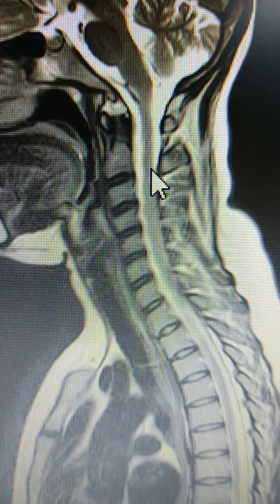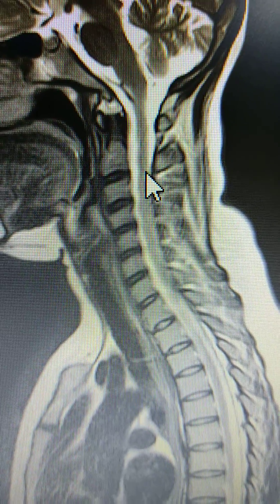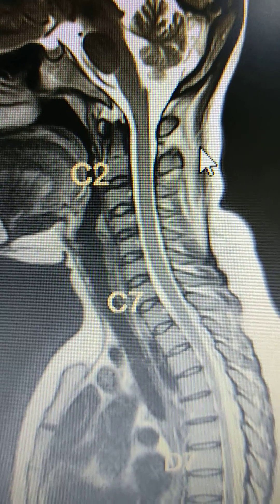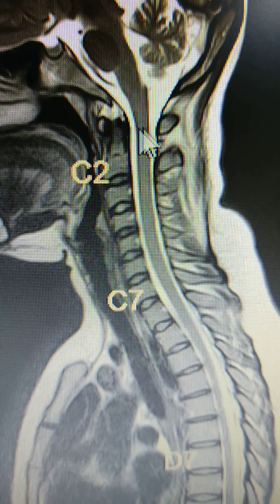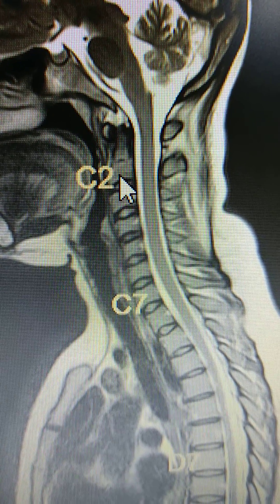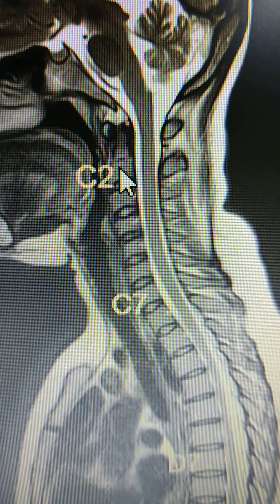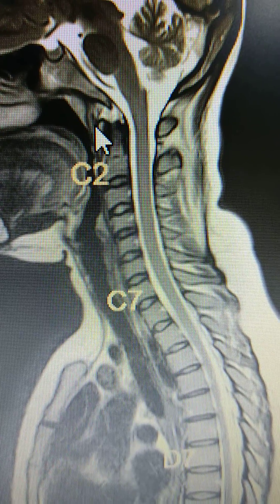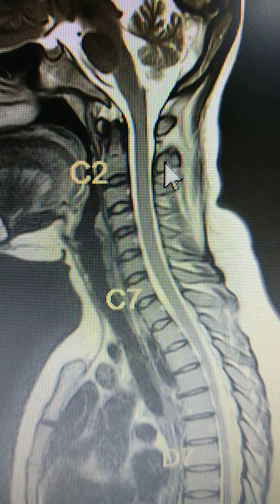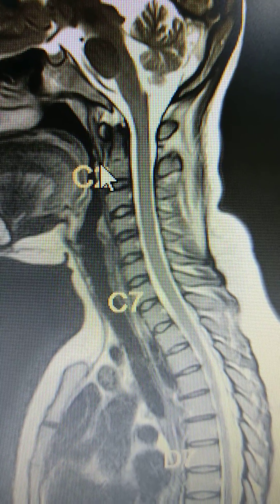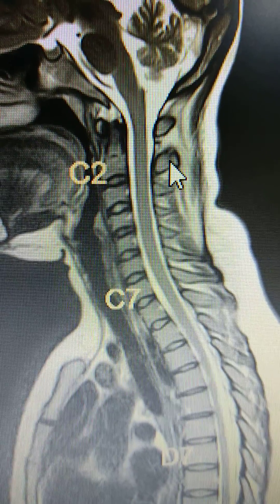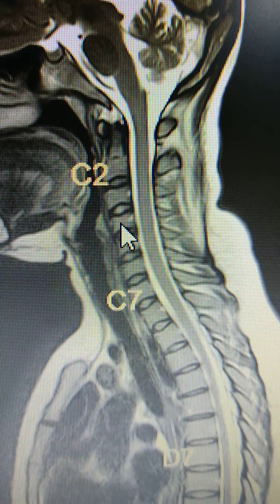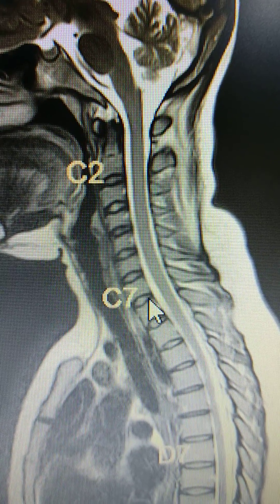You always need to count the vertebra from top to bottom. This is C1 — the atlas — and this is C2 — the axis. You have to count from there: 3, 4, 5, 6, and this is C7.